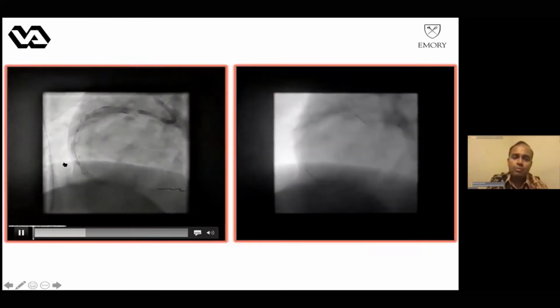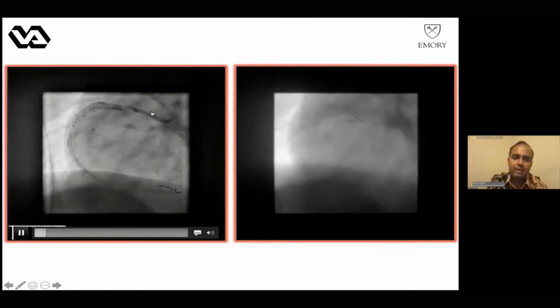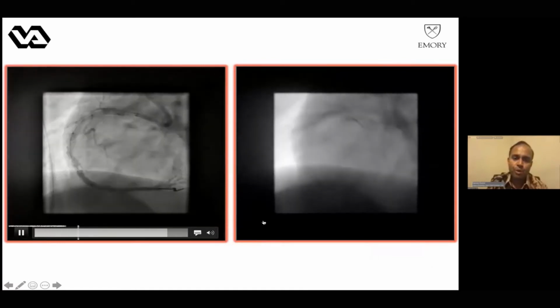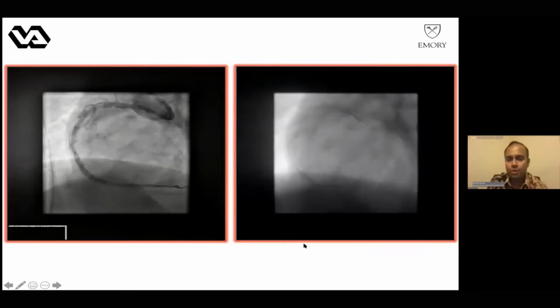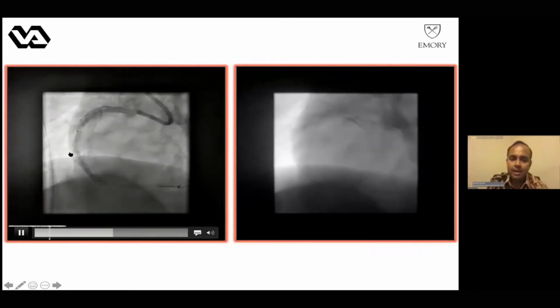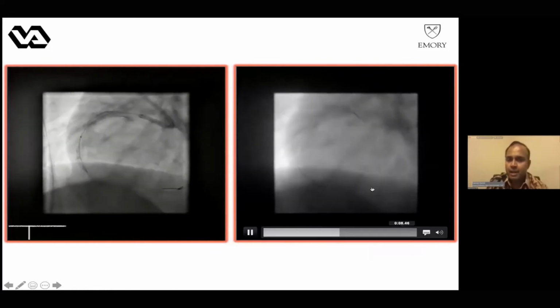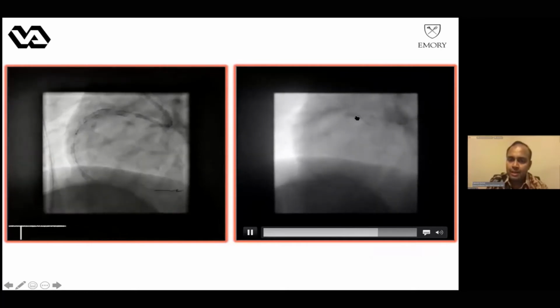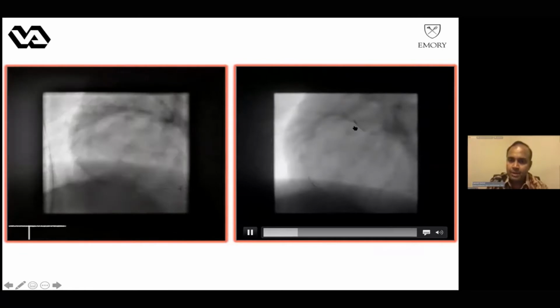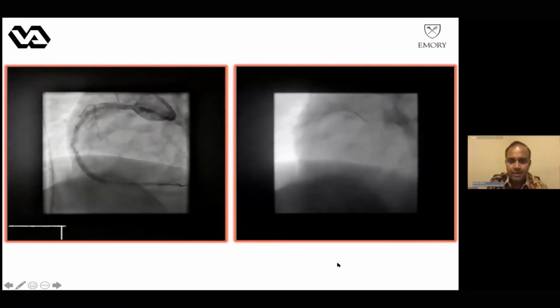And so at this point, my partner and I didn't really take too many pictures. We disengaged, we kept our guide disengaged, just took a little puff to ensure there was flow, went back in with a new coronary shockwave balloon, and we retreated the area of underexpansion of the stent because that was our goal that day. After doing that, you could see that there is now dye staining in the sinus of Valsalva with a little bit of contrast extending there. And you're able to see that.